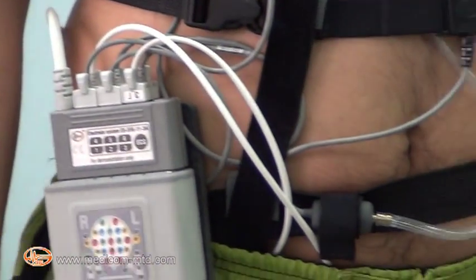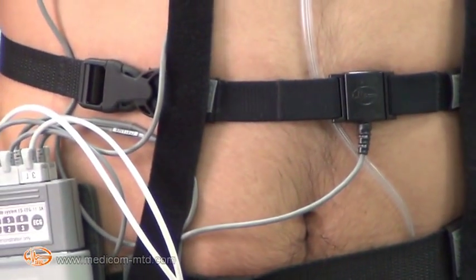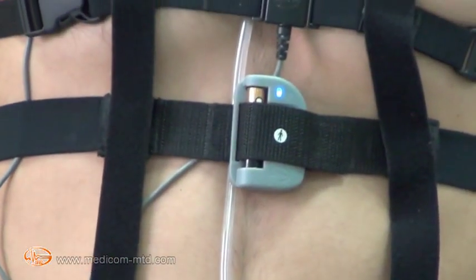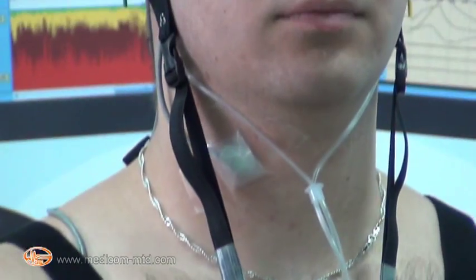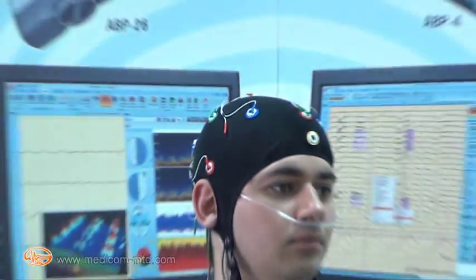The patient transceiver recorder is placed in a cover on the back belt with electrode system connector and additional sensors: sensors of respiration effort, thoracic and abdominal; wireless body position sensor; snore sensor; pressure airflow sensor; and a cannula attached in the nasal passages.